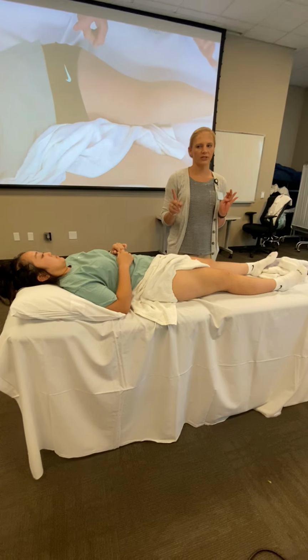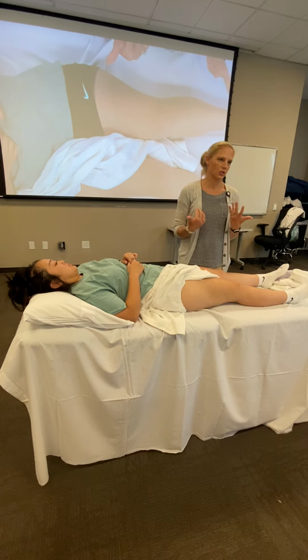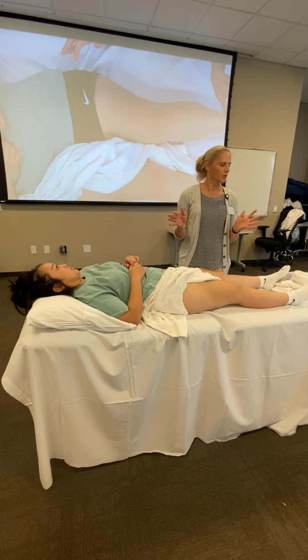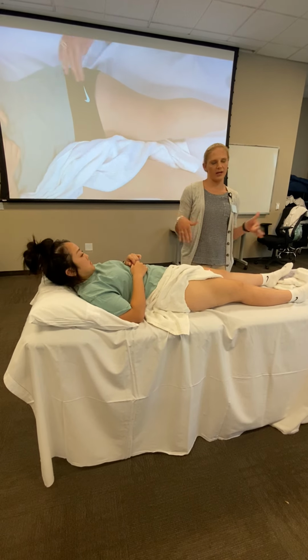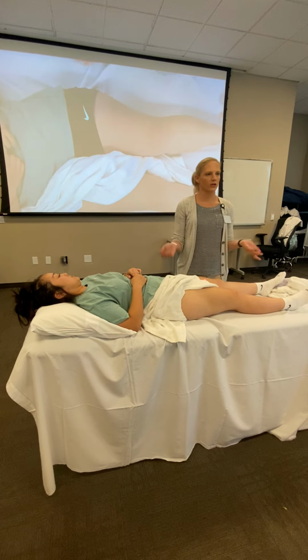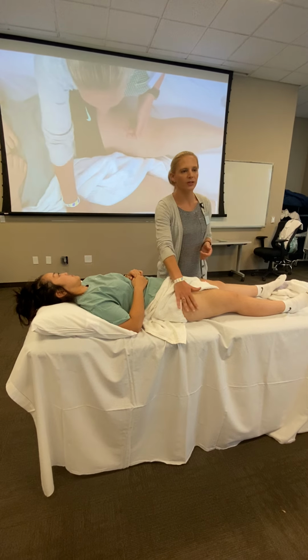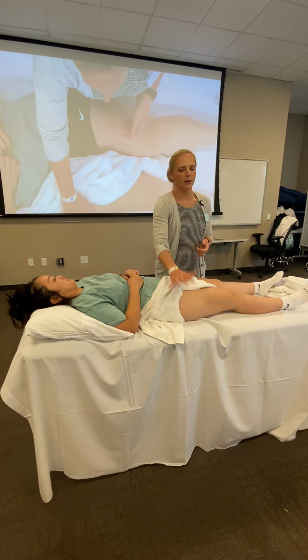Extension, internal, external rotation, and then there's also a seated hip internal, external rotation, which I think is much easier than the prone, but we'll show you both. But we'll have a pick. You can pick. Okay. If we show you multiple ways, you get to pick whichever is most beneficial, most comfortable to you. So for hip flexion, I'm gonna come over here.